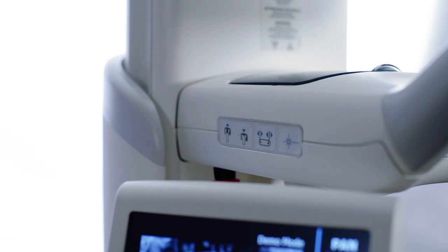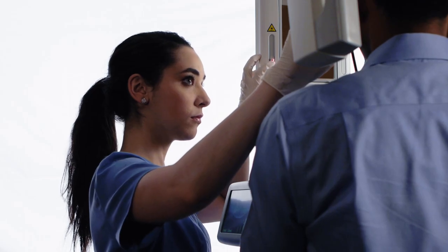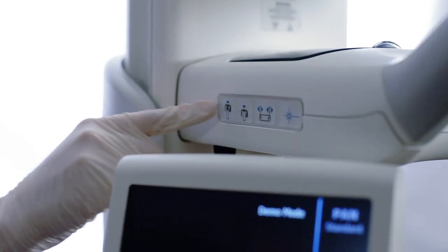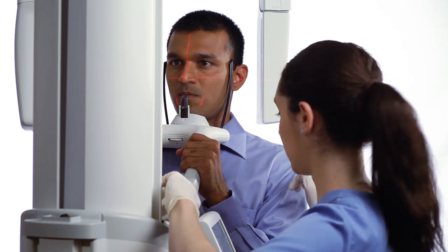Align the patient's head. Begin by drawing the Frankfurt plane laser up to align with the base of the patient's orbit and the top of the ear canal. Use the height of the positioning table to tilt the patient's chin higher or lower, bringing the Frankfurt plane horizontal.